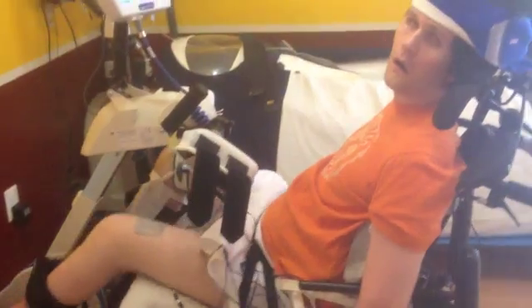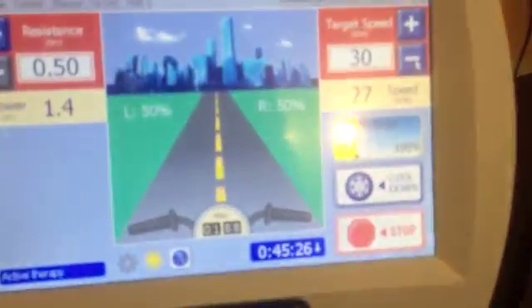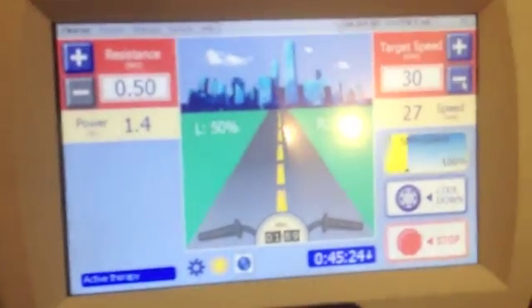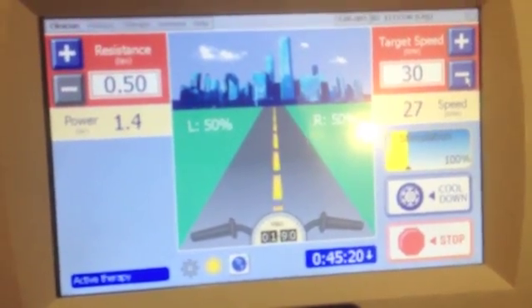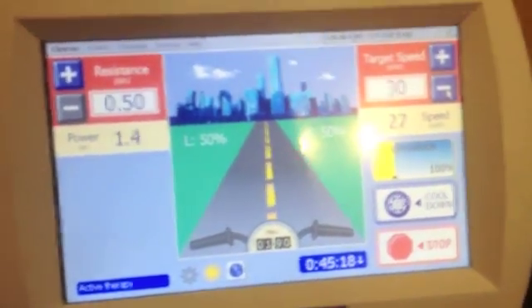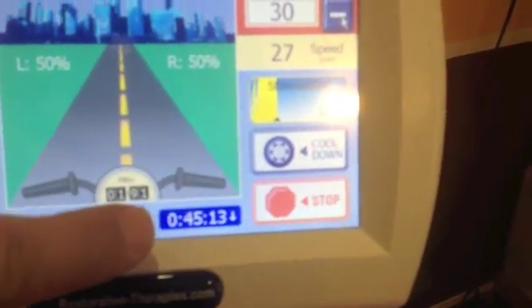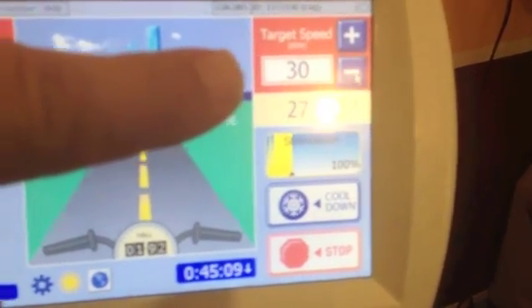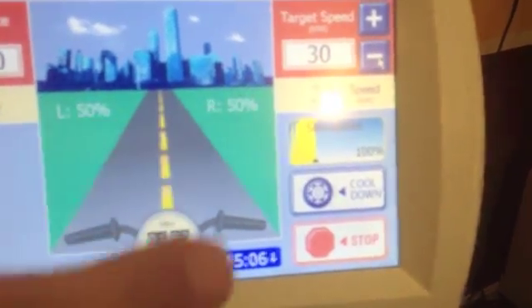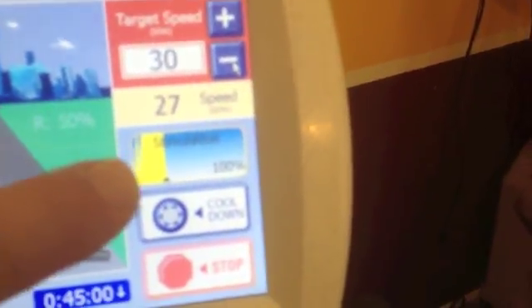I'll get a shot when he's back to his arms. He's still pushing that out on his own for the most part. He has an hour session and has 45 minutes left, going at 30 revolutions per minute. That's his target, and he's achieving 27 to 28. Right now it's at 100% electrical stimulation.